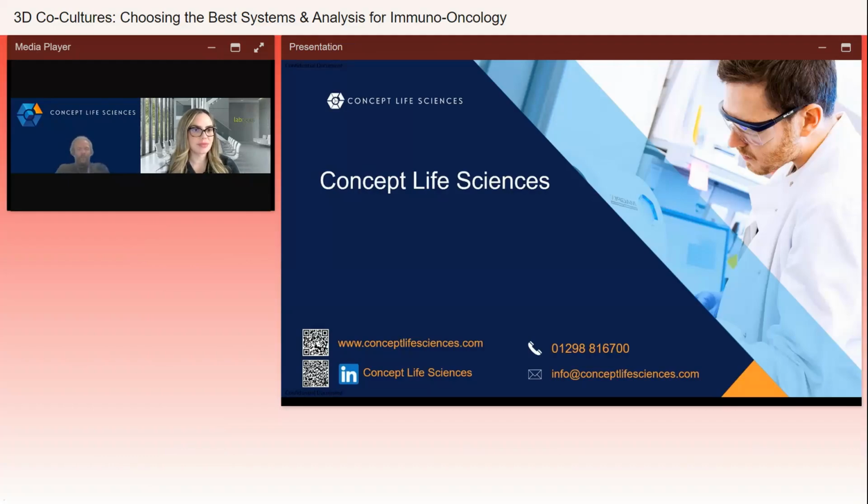And again, this will come down to what your cell types of choice are. There's no reason why you can't add those growth factors straight to your media. Obviously, one of the things we're trying to do is reduce the amount of things like serum we're adding to these systems, because obviously that's got factors that we've got little control over. But again, iPSCs, we're going to have to go completely serum free, so it's something we're trying to limit as well. But yeah, there's a few questions there.